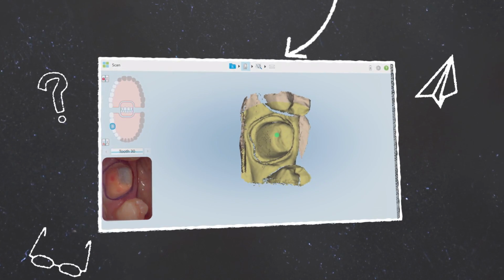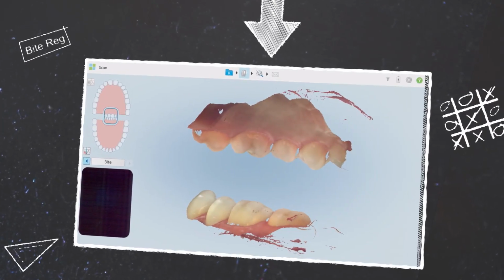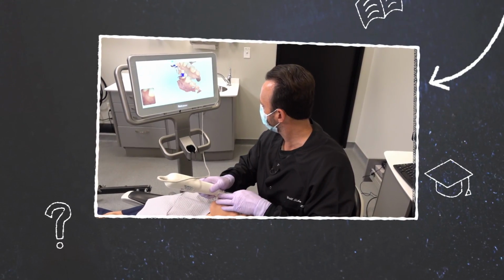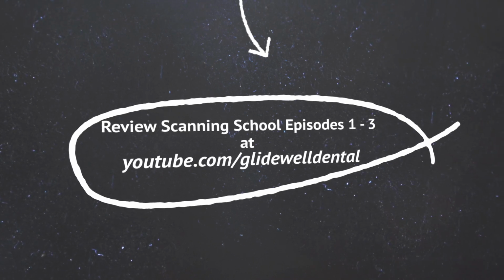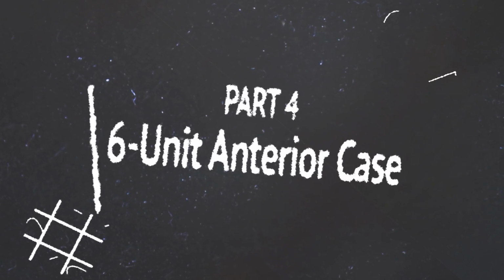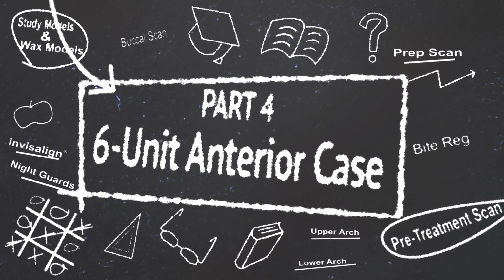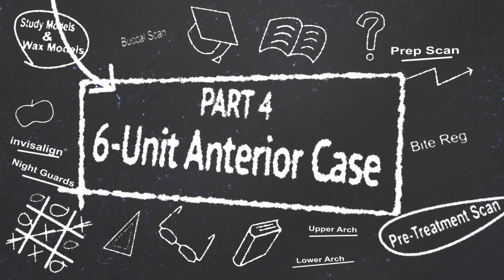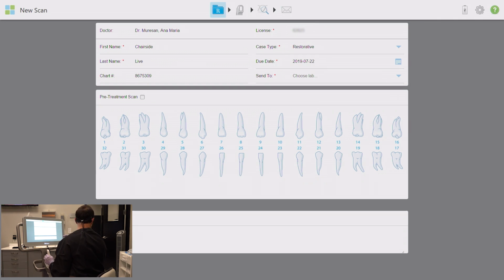Throughout this series, I have progressively presented cases that range from learning the basic operations of the scanner up to actual scanning and submission of prepared treatments for restorations. If you are just tuning in for the first time, take a moment to glance at some of my previous episodes, especially if you are a beginner with the iTero Element scanner. Today, we are going to level up from a single prepared crown case by now acquiring information for a 6-unit anterior cosmetic crown treatment. Let's start by entering the specific information for each tooth we are scanning.